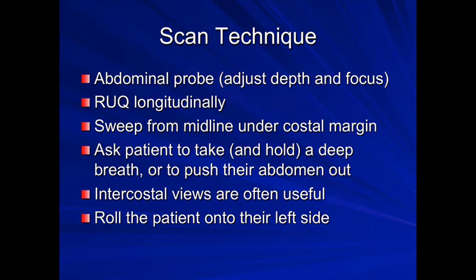Now we can do all of this with the patient lying supine on their back, but usually we'll get better views if the patient is lying on their left side in a left lateral decubitus position. And so that tends to be the standard position that we use when scanning the biliary system.